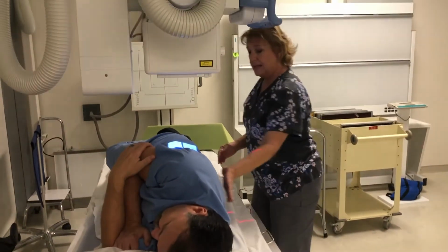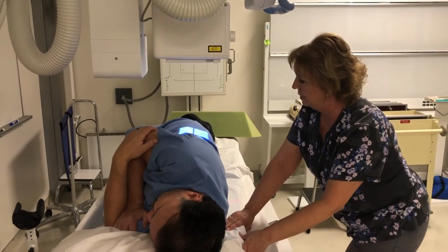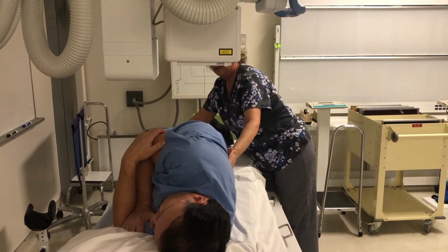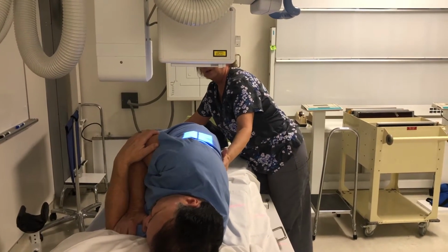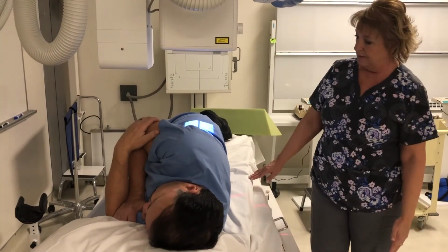And then as he's sitting here right now, the only thing I might do is bring him just a little bit forward. And again, the more of these you do, the more you'll understand the different types of body habitus and where to center. But that looks pretty good.